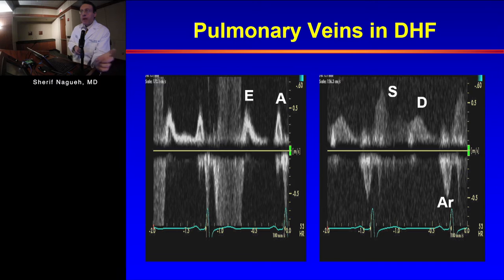Because these are two measurements and each one can come with its own errors, inexperienced operators or investigators or whoever is going to perform the measurement may have lower reproducibility on these time intervals, but you need crisp signals and you need to match RR intervals. There can be minor variations in cycle length, even in patients in sinus rhythm, as we frequently see.